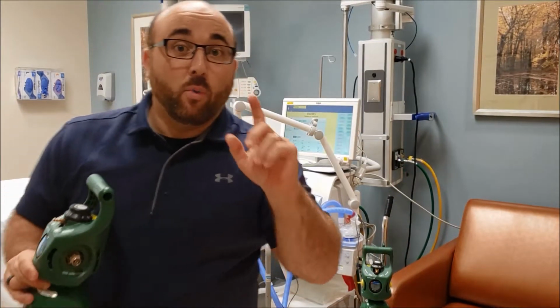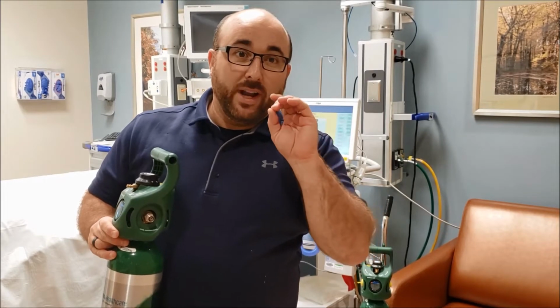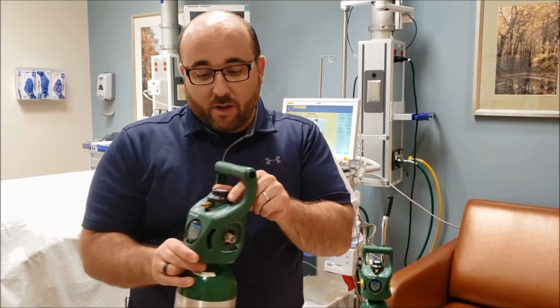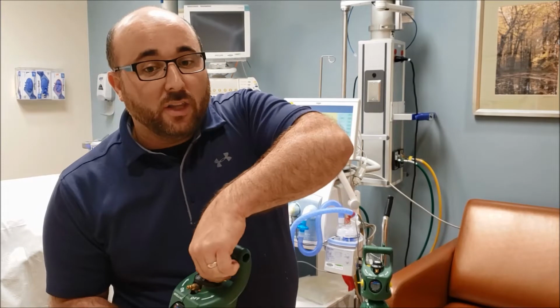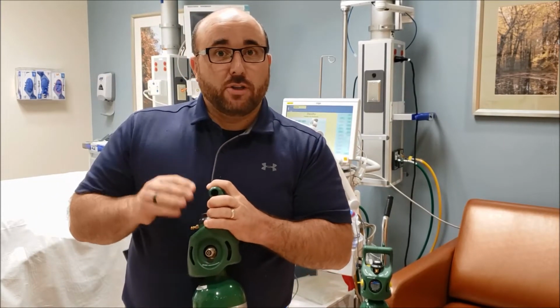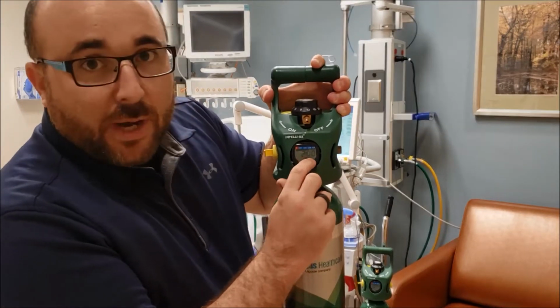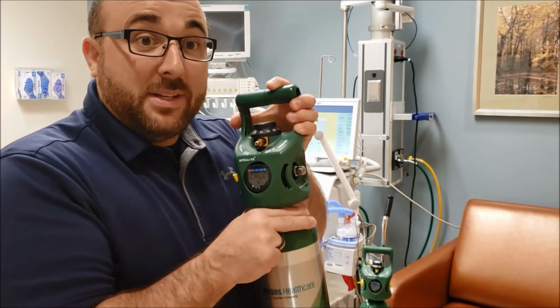The great thing about this is it's going to have 2 alarms on it. It's going to alarm once at 15 minutes to go, and it's also going to alarm when it has 1/4 of a tank. So if you're running on really high flows, you will get a little alarm. It's not a loud one, but it's enough to show you. After that alarm, if you look down at this, it'll no longer say 2 hours, it'll just have lines across it. That means it's about to run out.